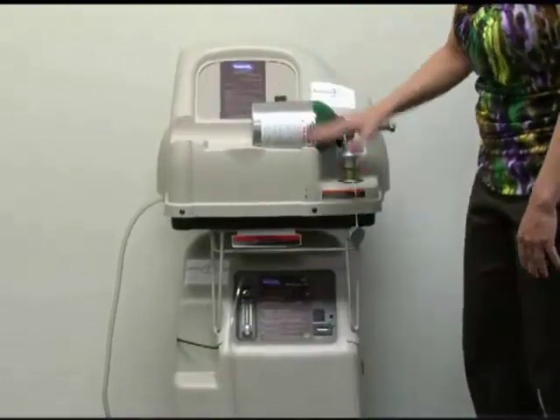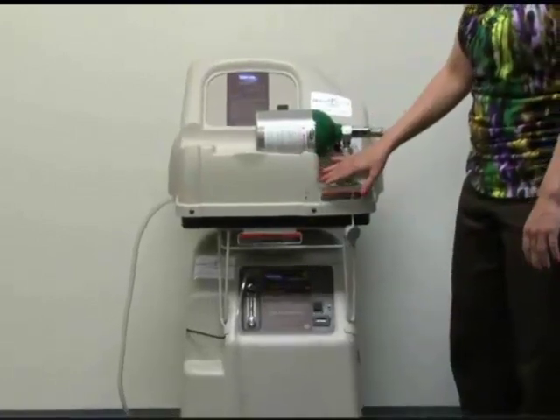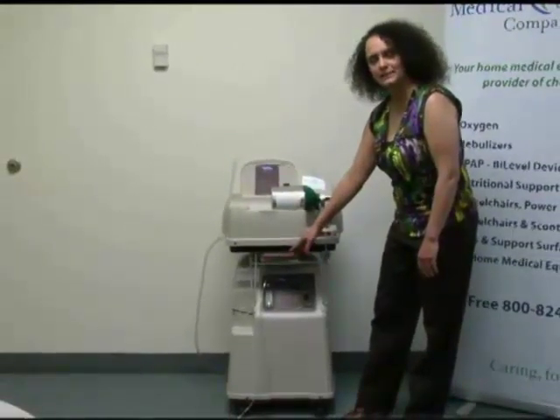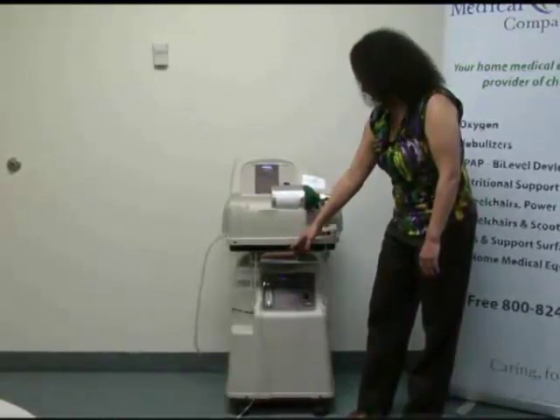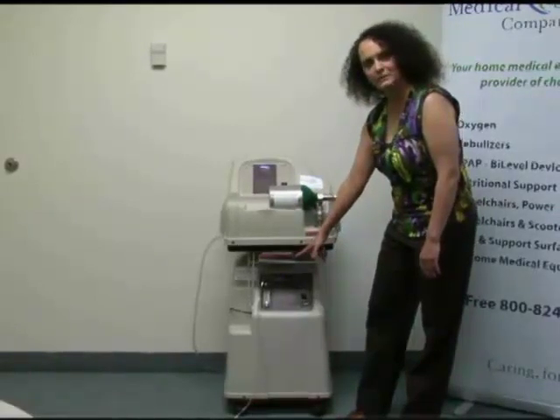Once you switch them on, they're going to make noise and they're going to alarm, but the alarm should stop. Remember that the liter flow down on the bottom will stay exactly where it is from wherever it was set — that should be set to whatever your doctor has ordered. Once it's on and running, that's all you have to do with the bottom part.